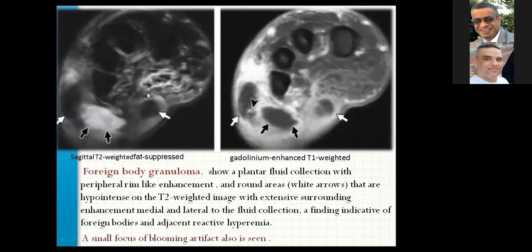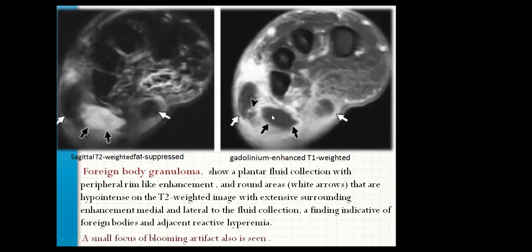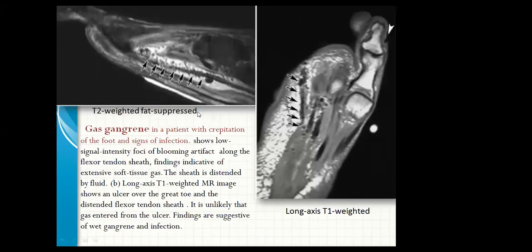Foreign body granuloma: MRI imaging shows a plantar fluid collection with peripheral rim-like enhancement and round areas that are hypointense on T2, medial and lateral to the fluid collection — findings indicative of foreign body and adjacent reactive hyperemia. A small focus of blooming artifact is also seen. Gas gangrene in patients with crepitation of the foot and signs of infection: MRI shows low signal intensity foci of blooming artifact along the flexor tendon sheath — findings indicative of extensive soft tissue gas. The sheath is distended by fluid. A long-axis T1-weighted MRI image shows an ulcer over the great toe and a distended flexor tendon sheath, suggestive of wet gangrene and infection.